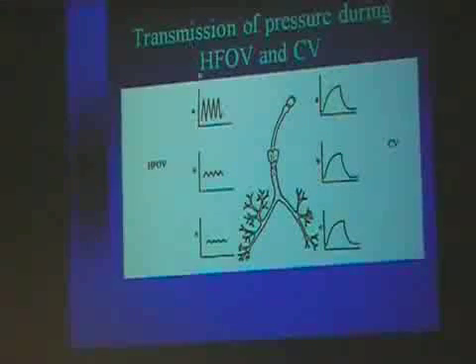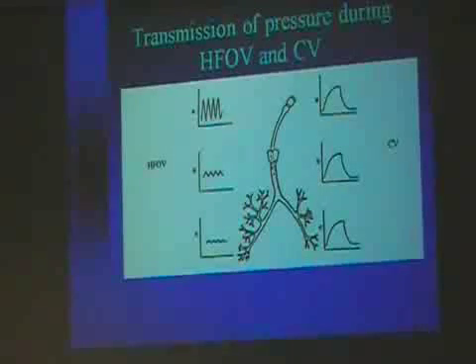So what we may see is, let's say, a delta P of 20 up here at the airway. I'm going to set a delta P of 20 on my baby. What are the units of that? It's a pressure. It's centimeters of water. Does that mean that the baby's saying, oh my God, 20 centimeters of water? No. Actually, with a 2.5 endotracheal tube, the attenuation is 90%, and what the lung sees is 2 centimeters of water, delta P.